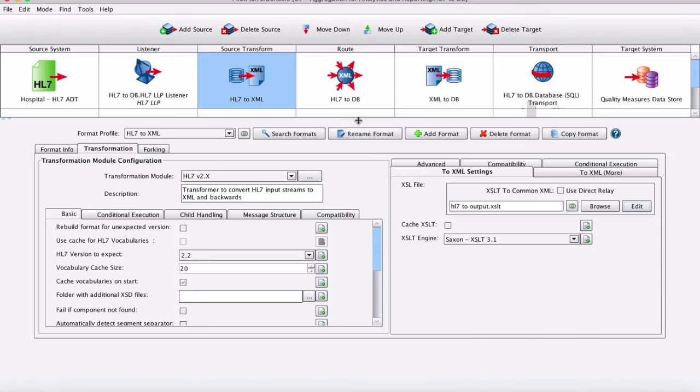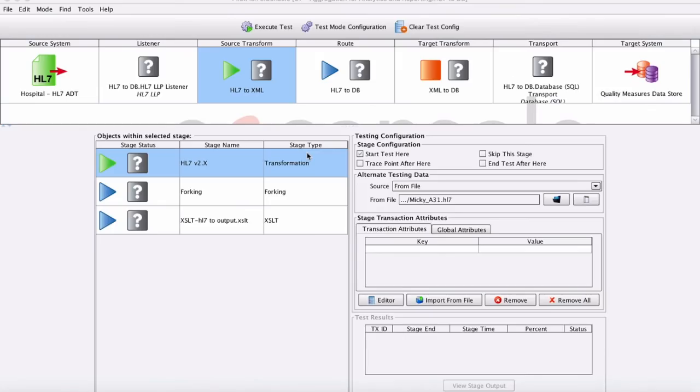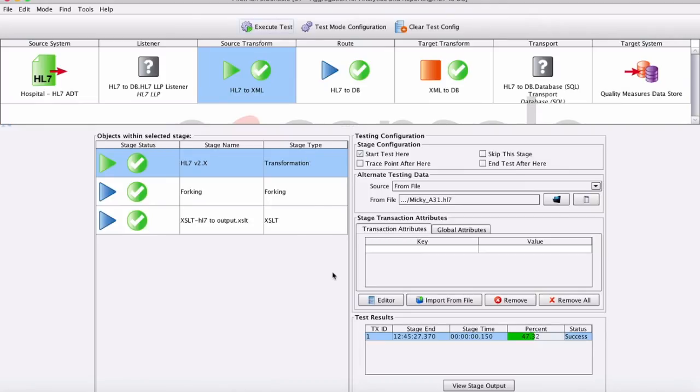When configuration and mapping are complete, test your interface. Test any stage or the entire process from end to end. View the data at each and every point along the way.